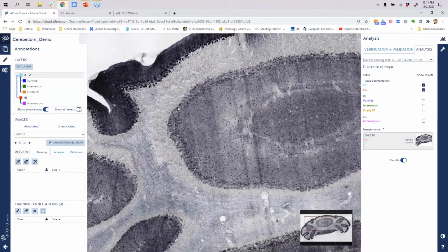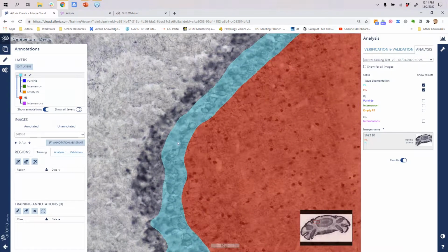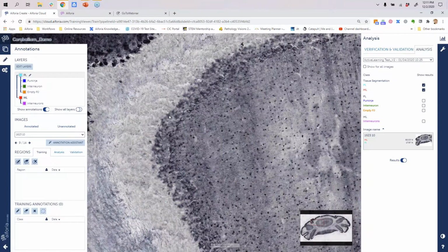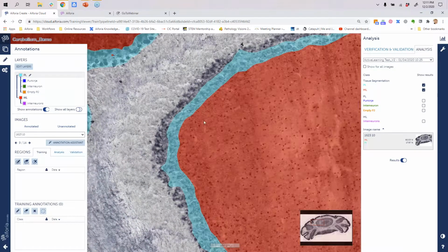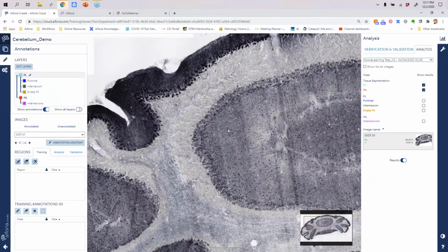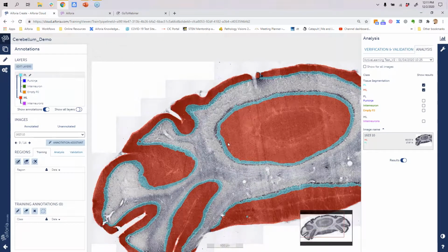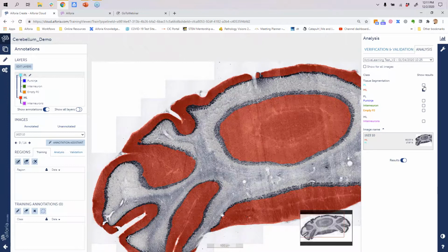And you see here that we've specified that this AI model should only detect high quality in focus tissue, because as soon as this layer was out of focus, it made labeling the ground truth for these different cell populations quite difficult and almost impossible. So to be conservative in our interpretation of the data, and as part of a QC step, we only included high quality tissue in this AI. So we can toggle those on and off individually.